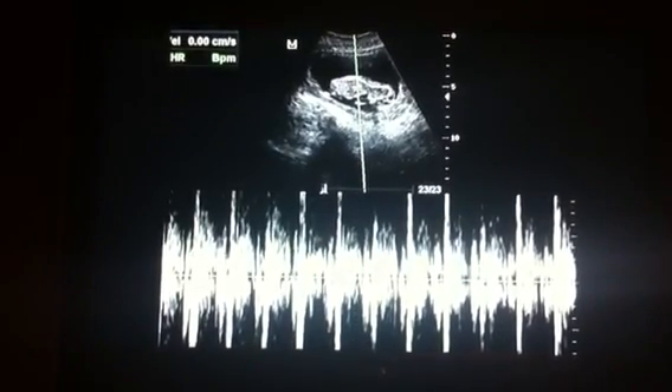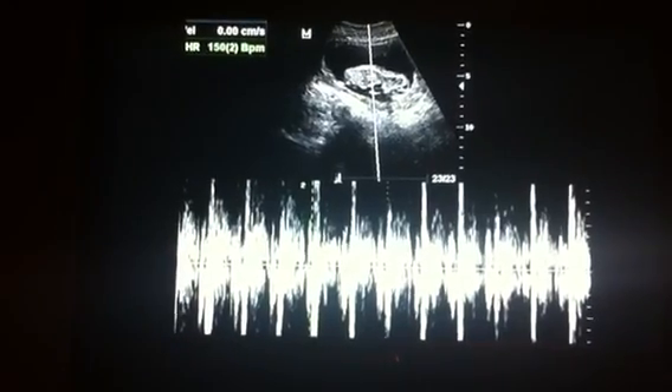I'm going to get heart rate. It's 151, that's great.